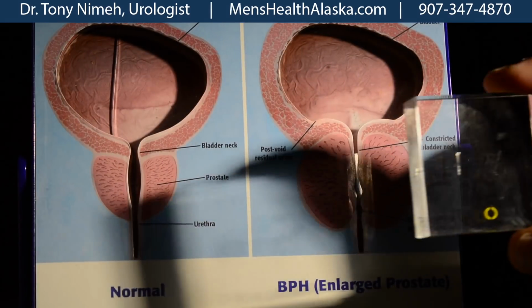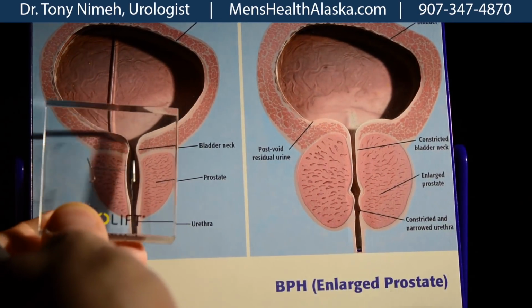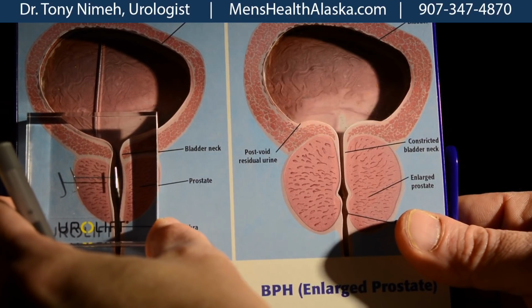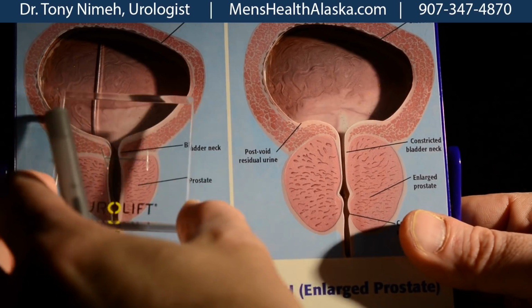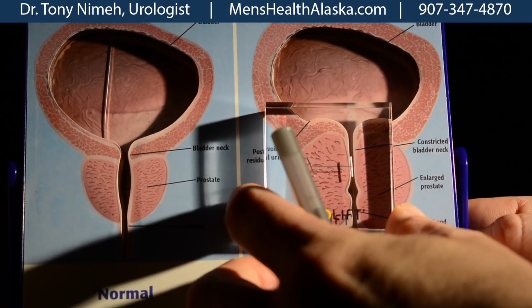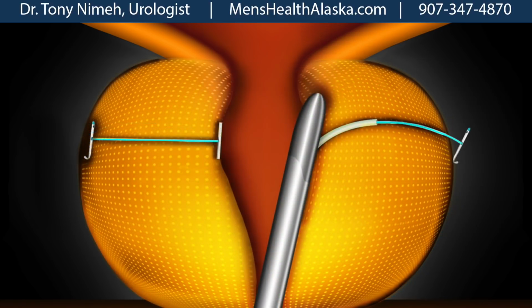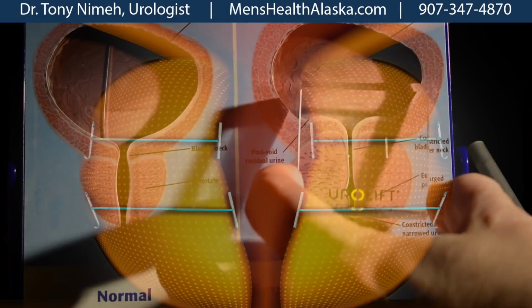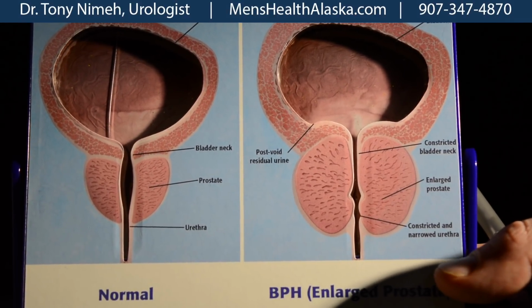So for example here, if I put the Urolift clip on this side, where the prostate is not enlarged, you will see that it is not going to change anything, because the clip is the same width as the prostate, so this would not change anything in this case. But on this side, if I anchor the outside of the clip on the outside of the prostate, and then bring the inside of the clip on the inside of the prostate outwards, the tube is going to get enlarged. And as the tube gets enlarged, we're going back to the situation that the patient was in when they were 20 or 25 years old.